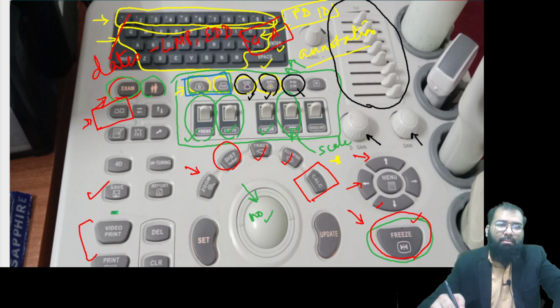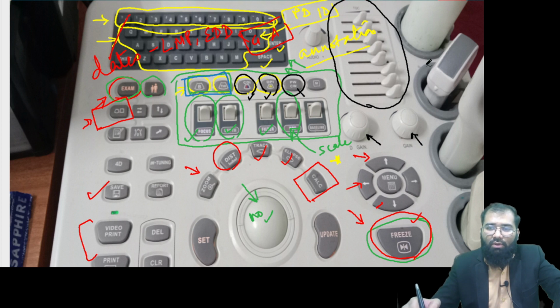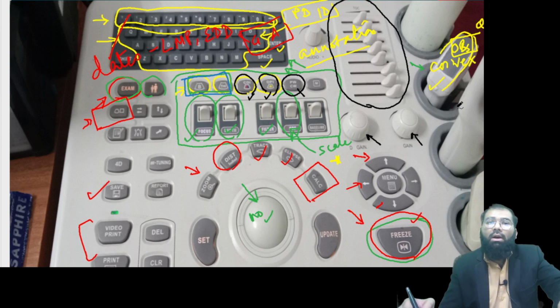Now, one more important thing which I would like you to see here in this image are this. So you can see that there are side knobs and where you have got this nicely placed. So this is the convex probe, or this is the abdominal probe. This is the probe which we routinely use for OBS, very important. So this probe is used for obstetric examination, and this is the same probe which we use for OBS Doppler, also fetal Doppler study. This convex probe is also used for fetal 2D echo, cardiac echo, etc., fetal anomaly scan. So routinely we do it with this probe.